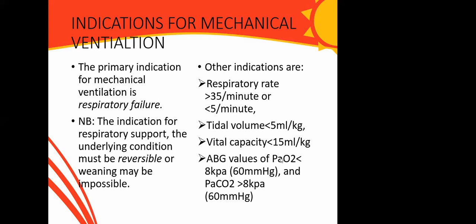Arterial blood gas values are very important. A PaO2 of less than 8 kilopascal or less than 60 millimeters of mercury, or a PaCO2 of greater than 8 kilopascal or greater than 60 millimeters of mercury. These are objective indications for initiating mechanical ventilation.